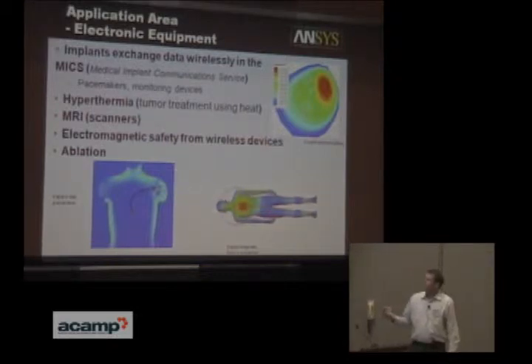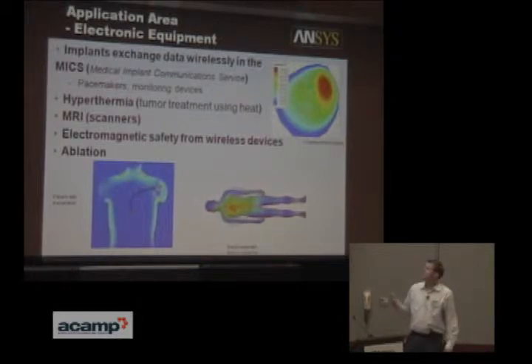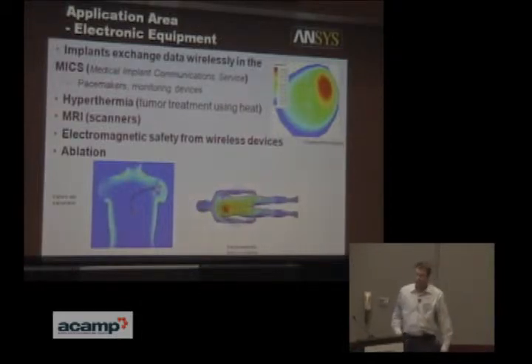Also looking again at the patient, we're looking at the heating in the body as the patient goes through the birdcage. And then finally, we're verifying that the heat's going to the right place, in the region of the tumor.